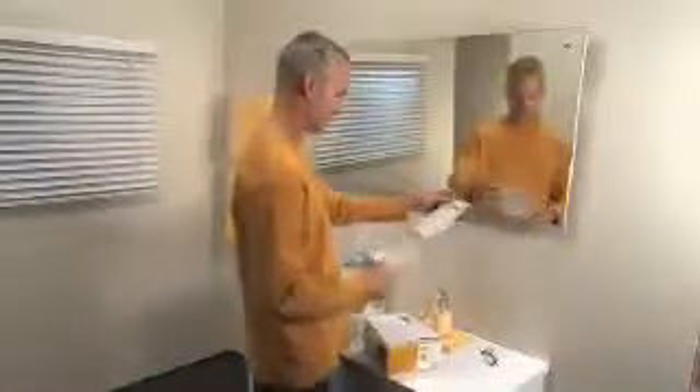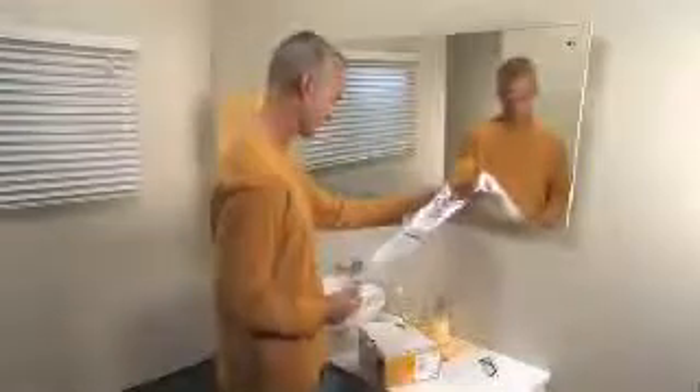You have just received a Fisher & Paykel Healthcare Mask for use with your CPAP device. In addition to this video, you should also consult your instruction manual for additional information regarding specific warnings and safety precautions. Some of the steps about to be demonstrated may already have been covered by your home care professional.